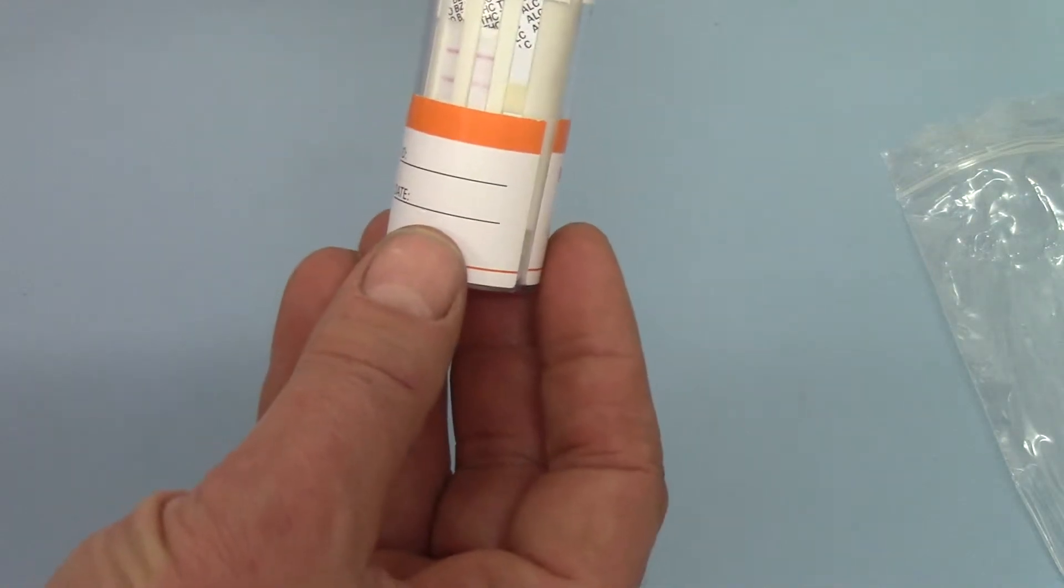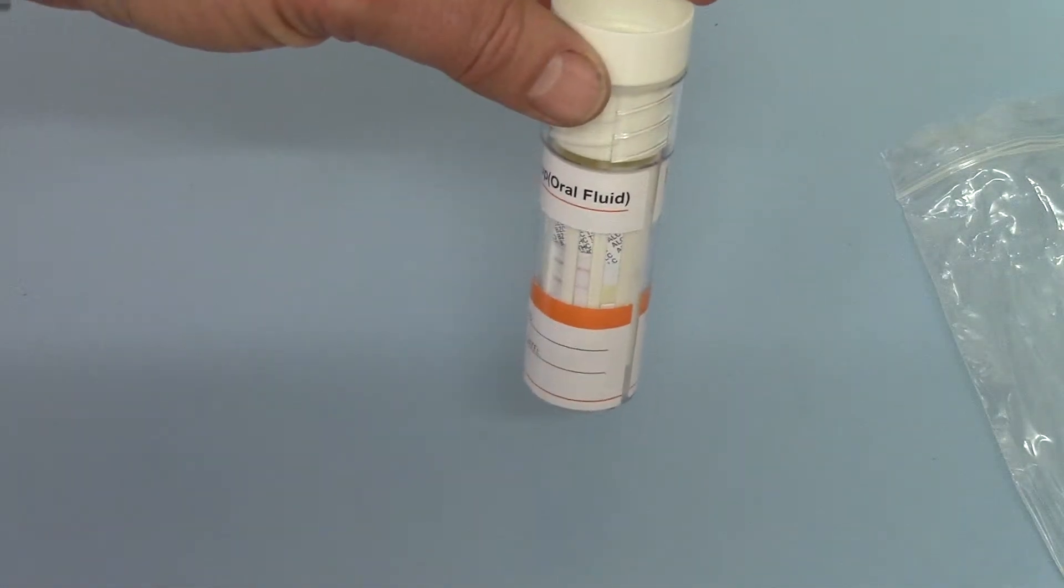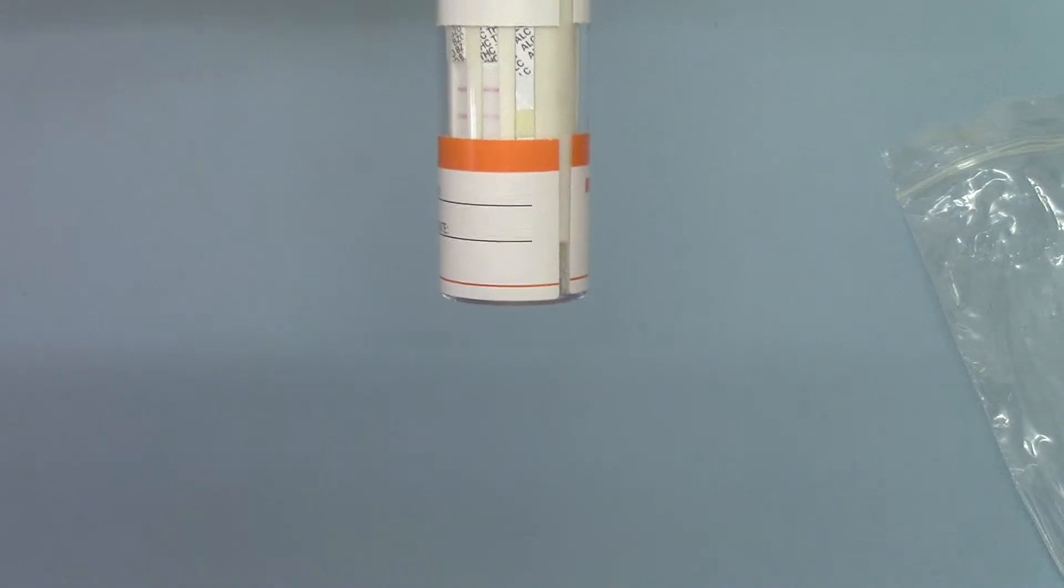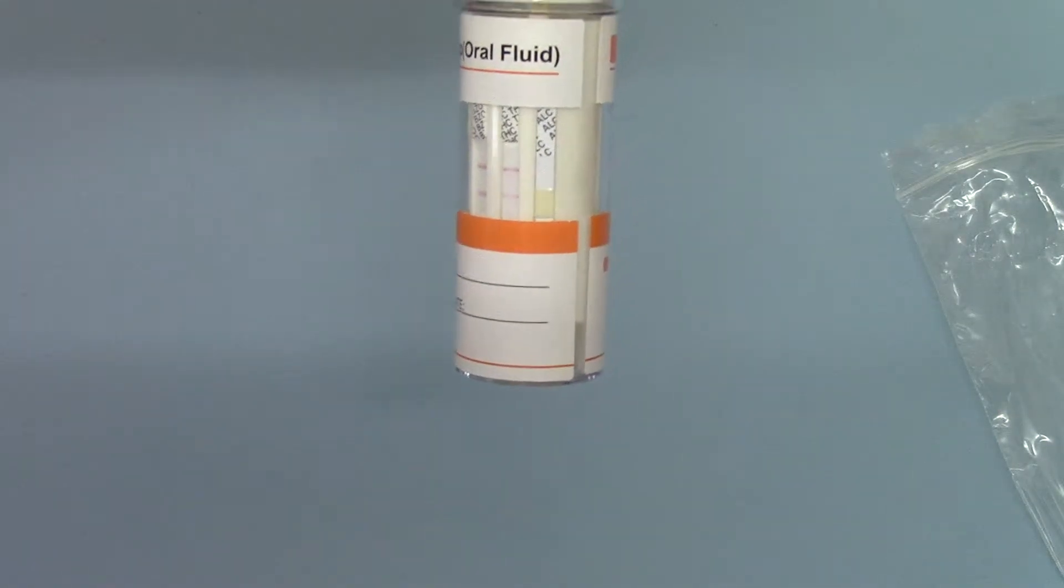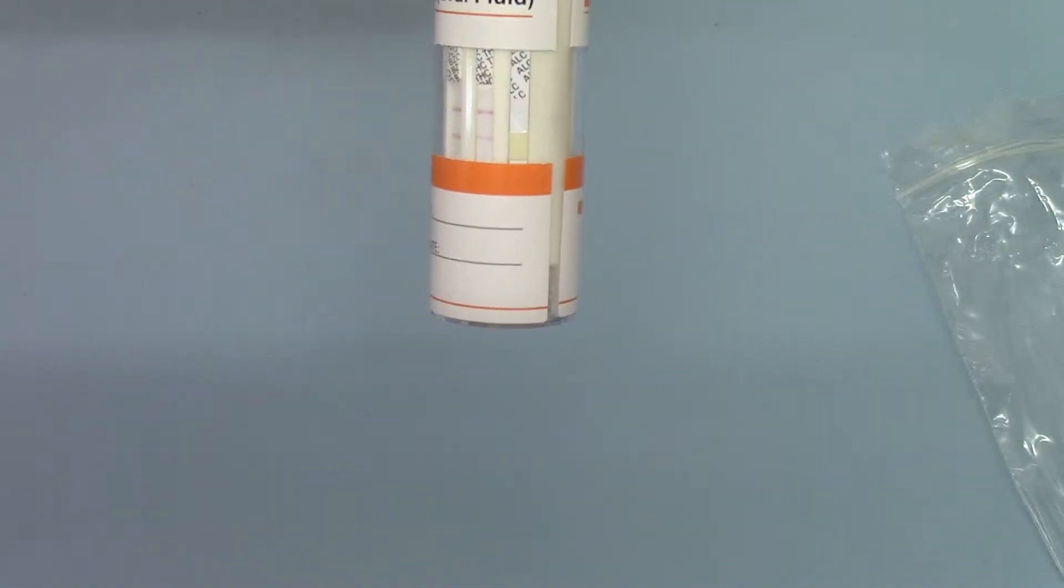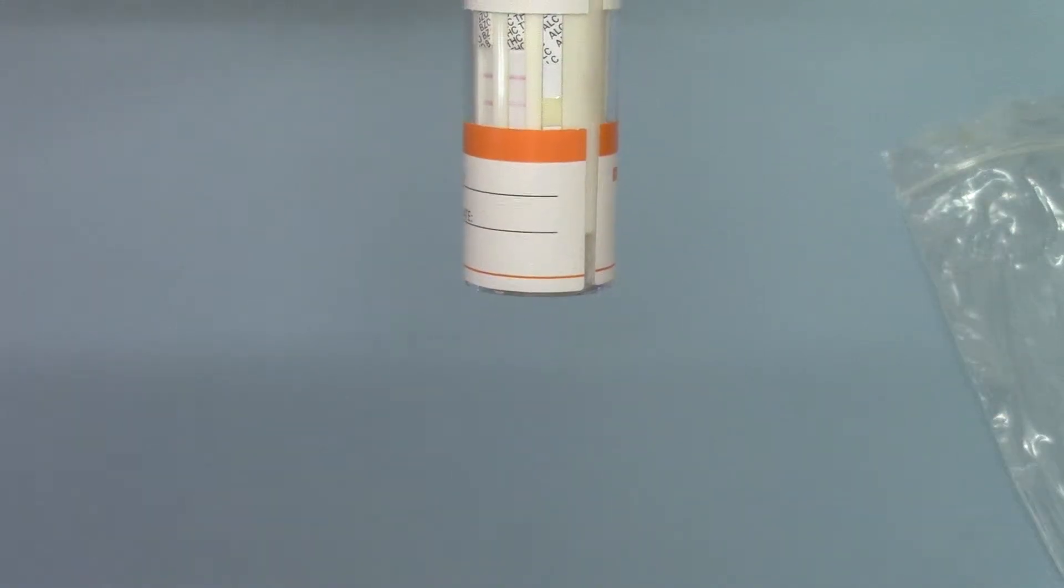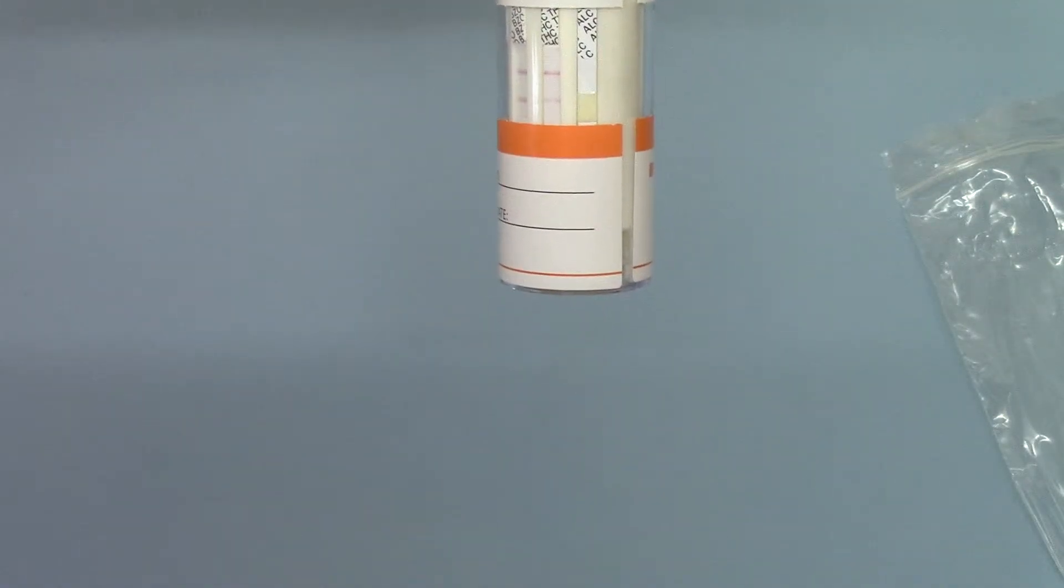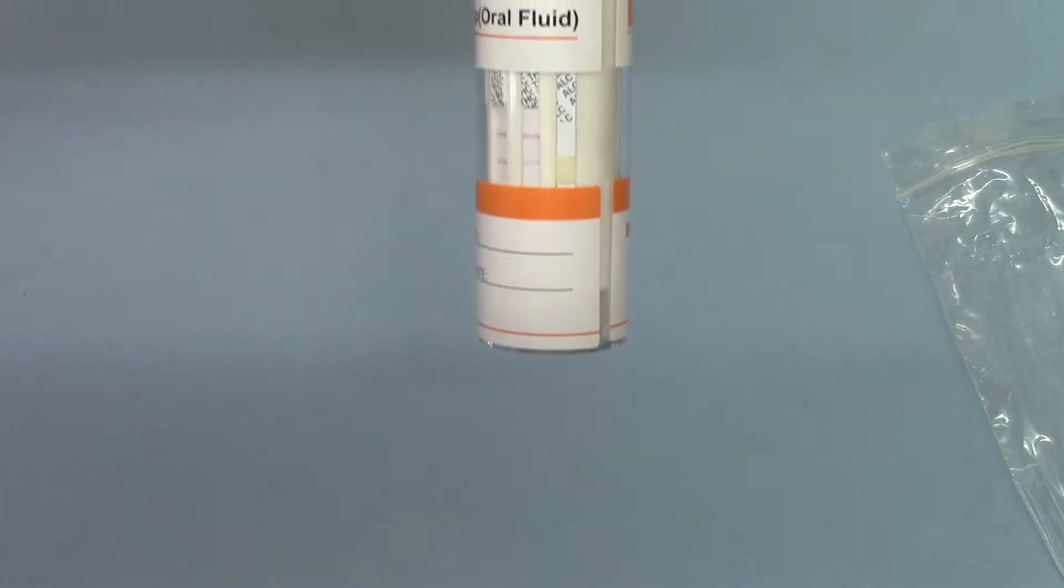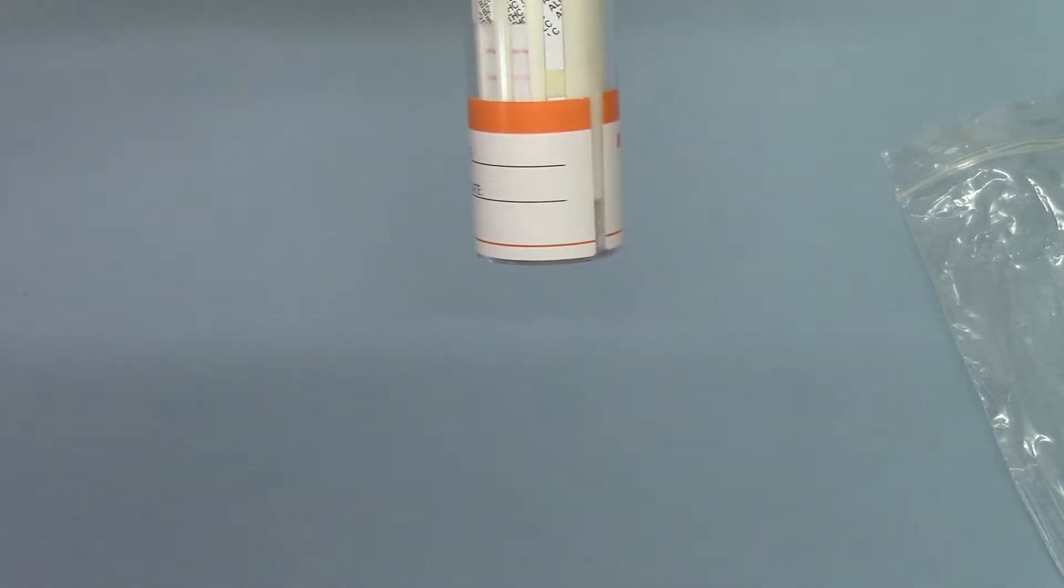And we're just waiting now for that final test. The interpretation of the alcohol, obviously you're looking for a color change on that pad. This one is a negative sample with just the cream baseline color still showing. You would get a duck egg through to a dark blue discoloration, which would match against the sheet given with the tests for the relative blood alcohol concentration.